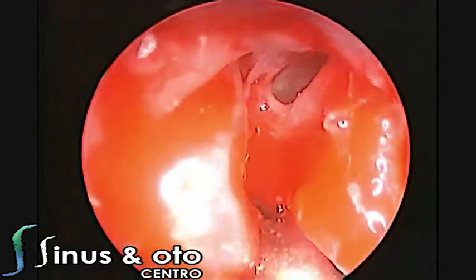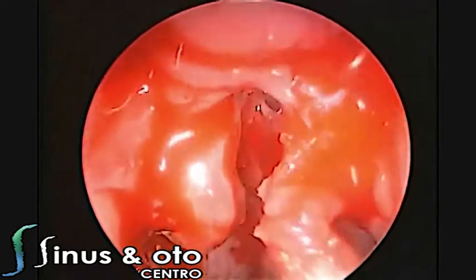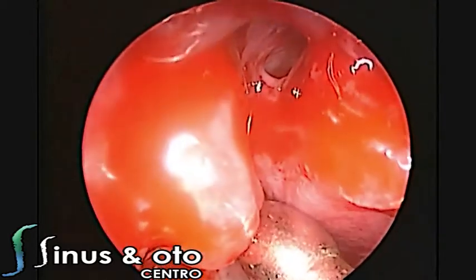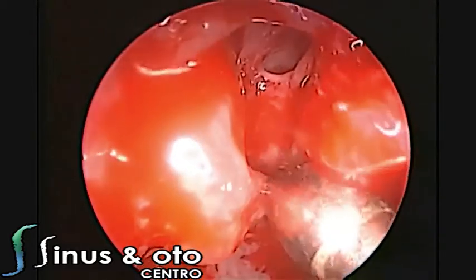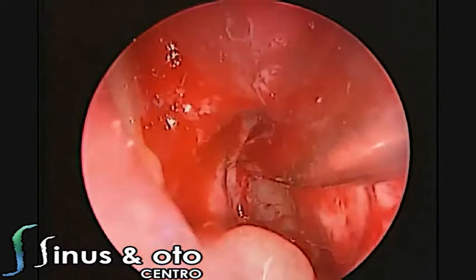As you can see, this is the maxillary sinus natural ostium — always angulated. So you have the infundibulum and then the maxillary sinus natural ostium.